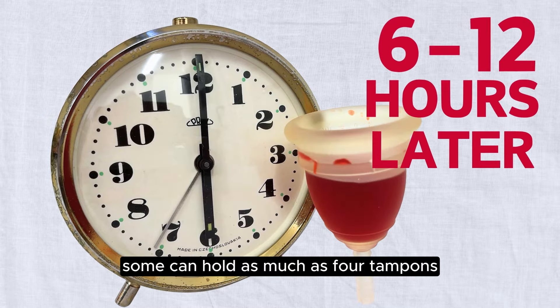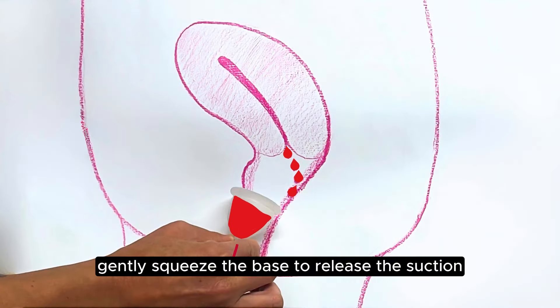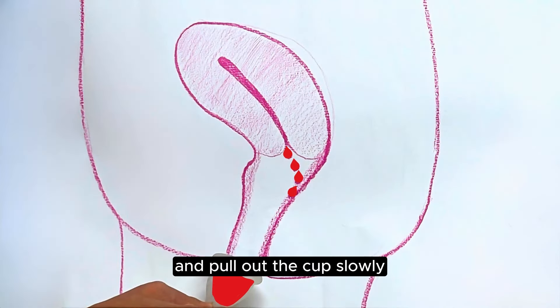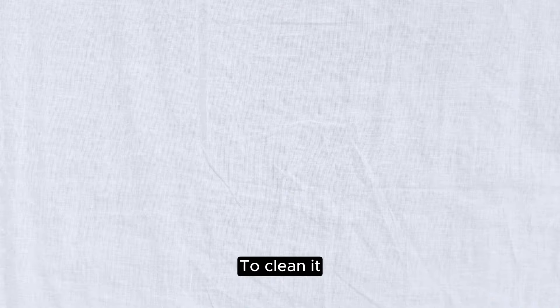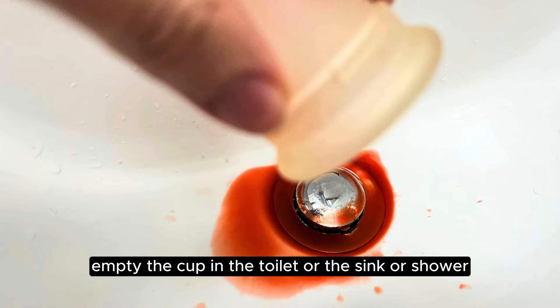Some cups can hold as much as four tampons. When removing, gently squeeze the base to release the suction and pull the cup out slowly. To clean it, empty the cup in the toilet, or in the sink or shower, and rinse with water.